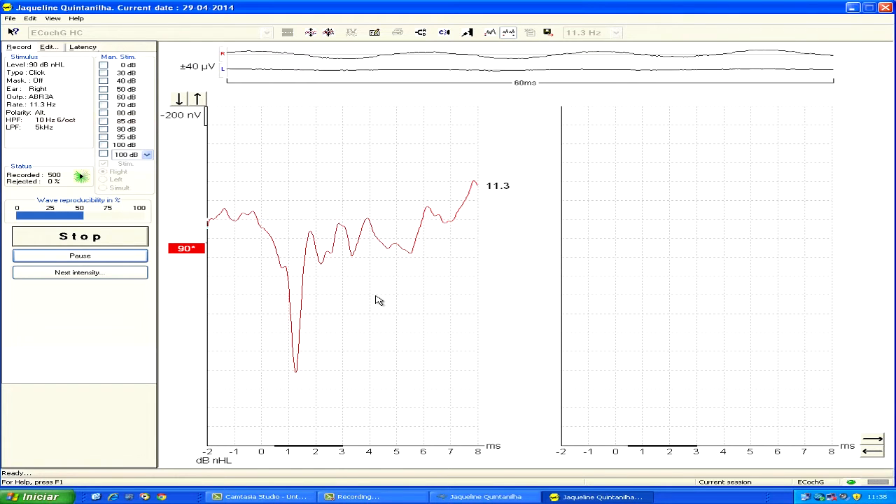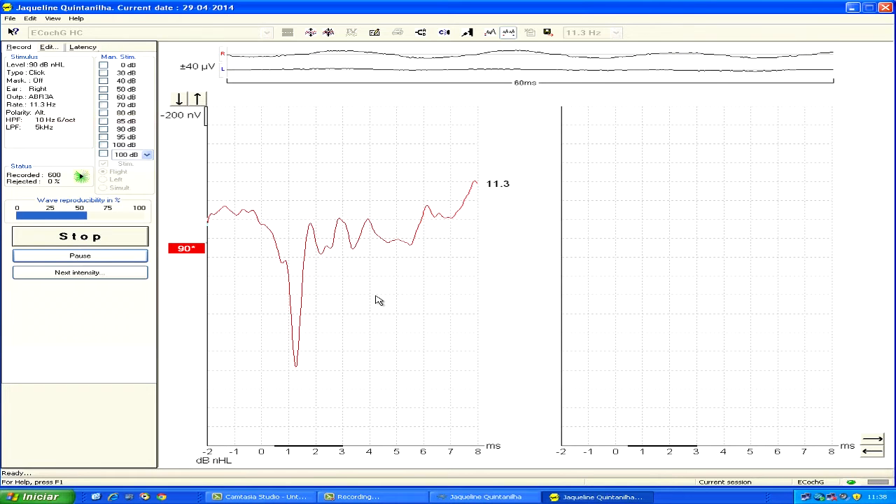We find it helpful to analyze first the waveform morphology and AP latency. It is a good procedure to collect several curves and to select the best curves for analysis.